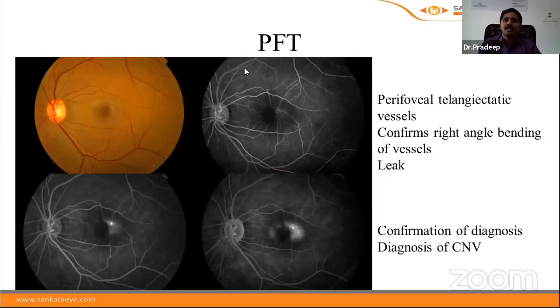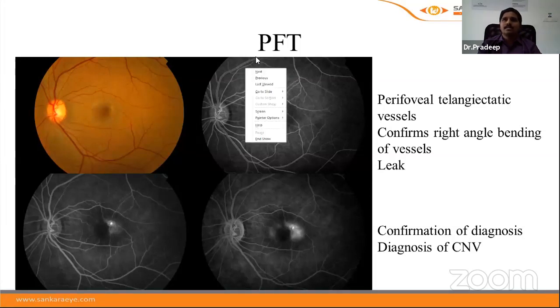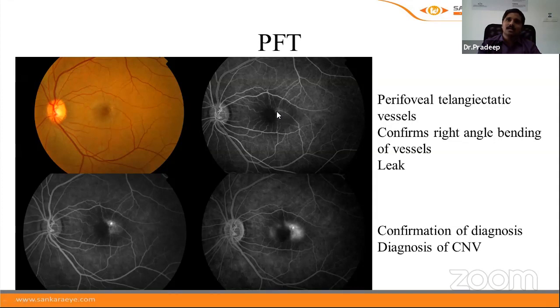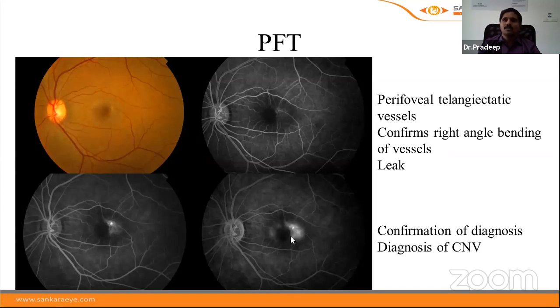Perifoveal telangiectasia is a degenerative retinal disorder with perifoveal telangiectatic vessels and gradual retinal tissue degeneration. FFA shows perifoveal telangiectatic vessels and confirms right-angled bending of vessels — the vessel abruptly diving into the retinal substance. In the late phase, leak may also be seen. These cases can develop choroidal neovascular membrane. FFA helps confirm the diagnosis of perifoveal telangiectasia and identify any associated CNV.